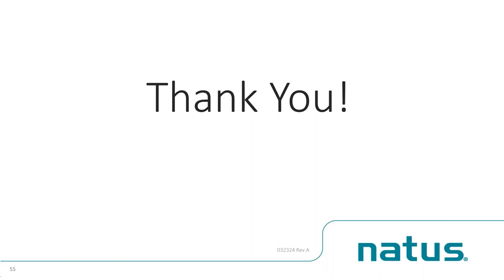Don't go like, okay, relax. Now activate again, relax, activate. That's not a good strategy. Once you get a good force level after about 30 or 40 seconds, focus on recording, keep moving the needle.